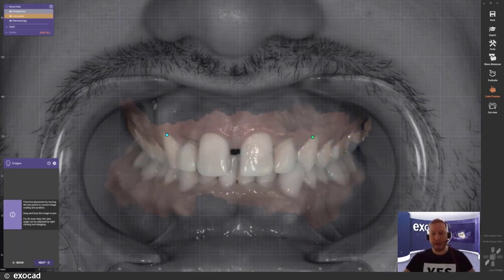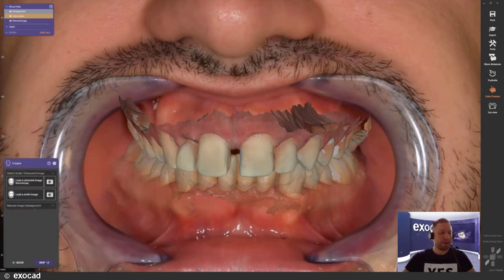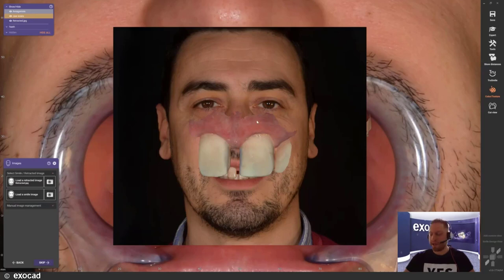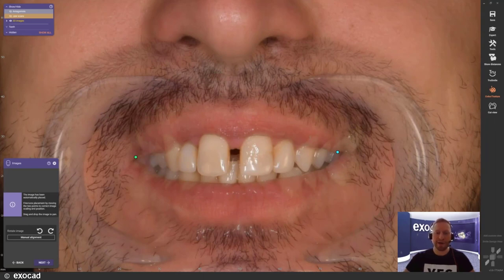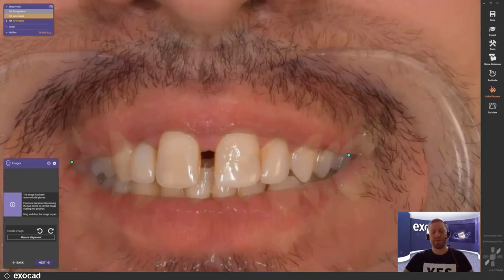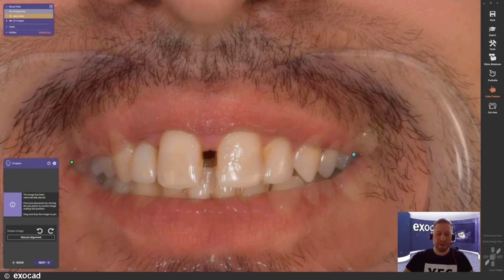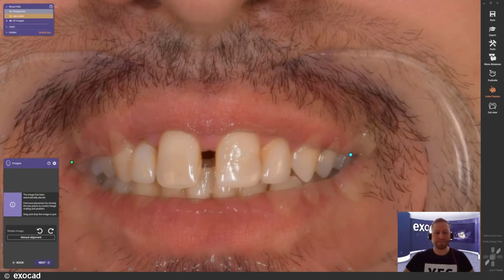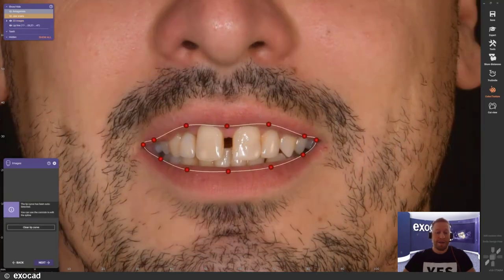I'm fine with this alignment result. If there are difficulties, you also have the option to right-click and rotate the scan in the background for more optimization. Once you're happy with the alignment, load the smiling picture. Here you see the first impression of the AI empowered facial feature recognition — two different pictures overlaying, with shades of the retractor visible and tooth outlines, already positioned in a fairly nice alignment.